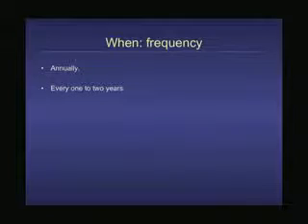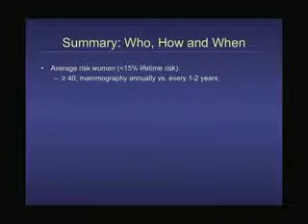So frequency, meaning how often are we supposed to get a screening mammogram? Some say annually, some say every 1 to 2 years, all right? So in summary, the who, how, and when.